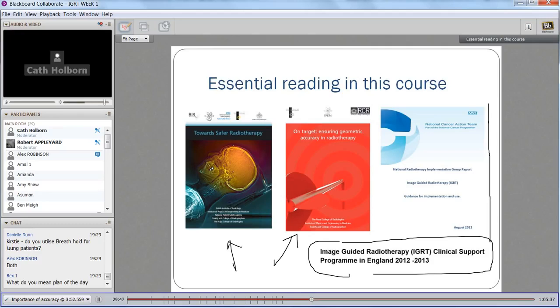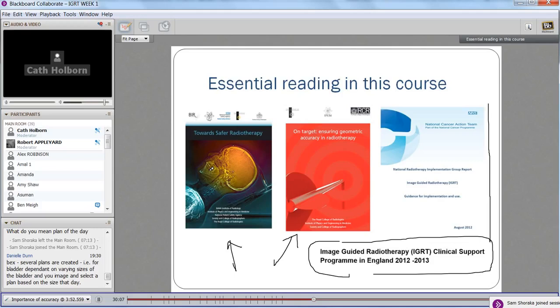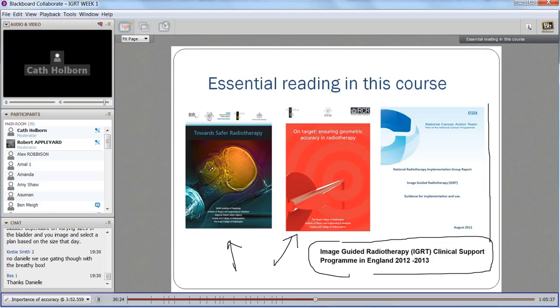Yeah, go ahead. The main point to make about adaptive radiotherapy is the main premise of it, that it goes further than just correcting for geometric positional changes. The standard with IGRT treatment verification is that we measure an error that might be translational and also rotational, and then we correct for that positional error. So that's correcting for changes in position.